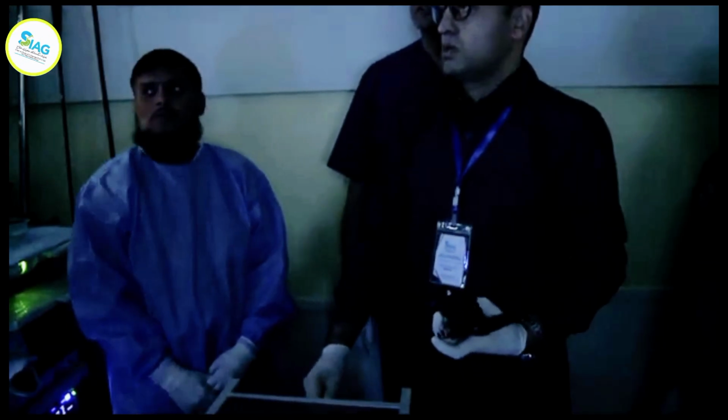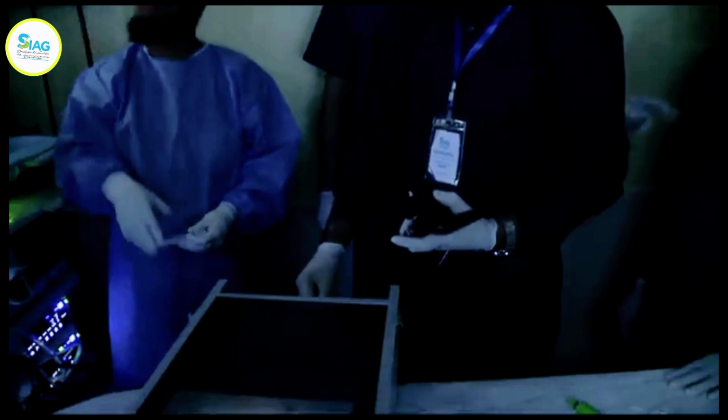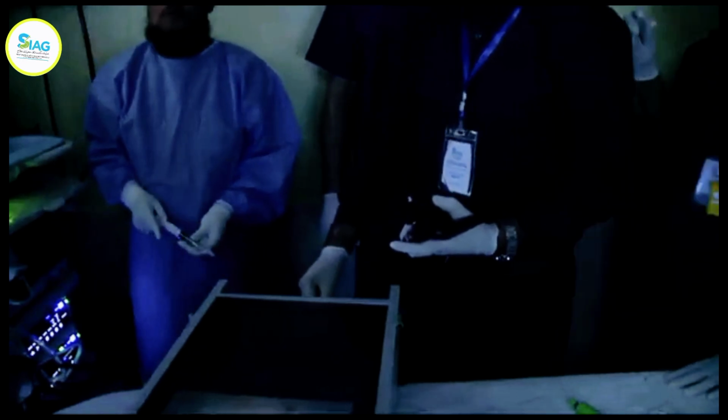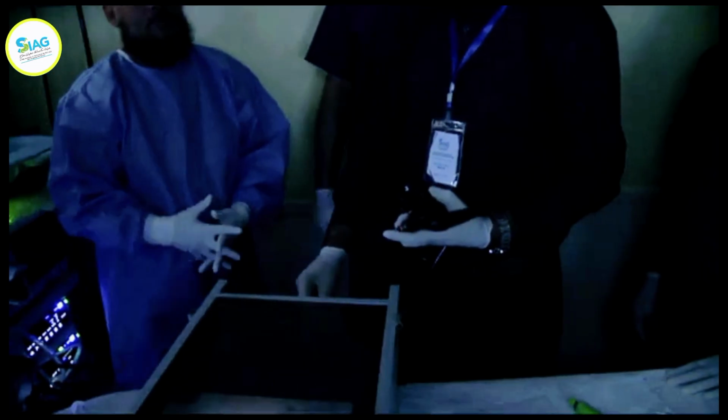So you can see it there, right? Can you all see the EUS? यही है ना सिस्टम हमारी। इसमें क्या क्या डाला हुआ है? Now you see the EUS. Saad bhai, can you hear me? Yeah, I can hear you. We do see the EUS now. You can see the EUS image? Yes. You can see the cyst nicely, I hope?